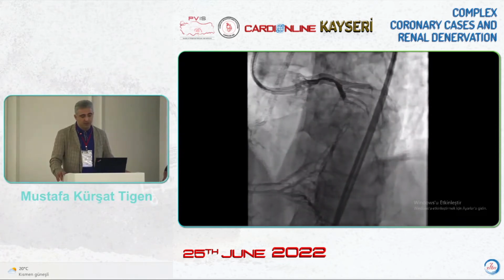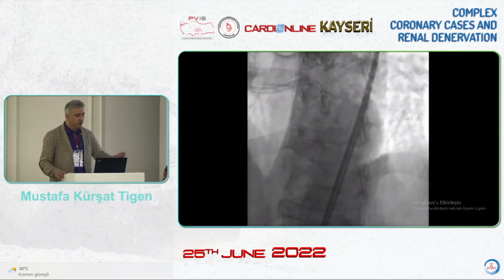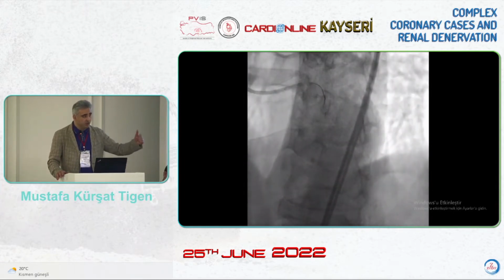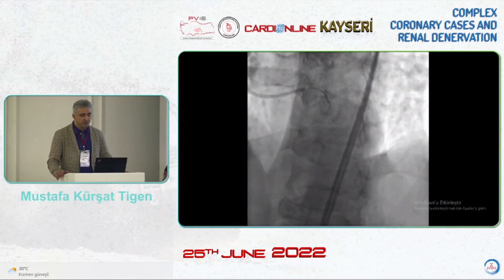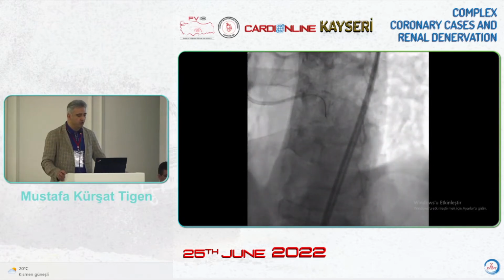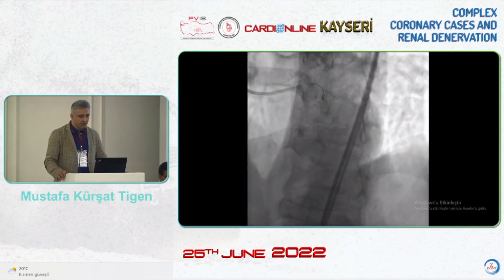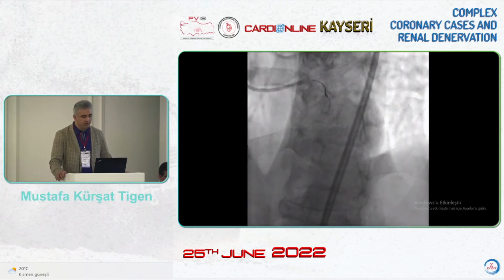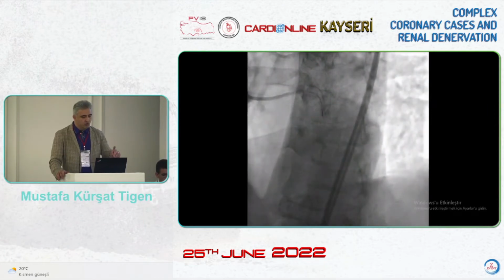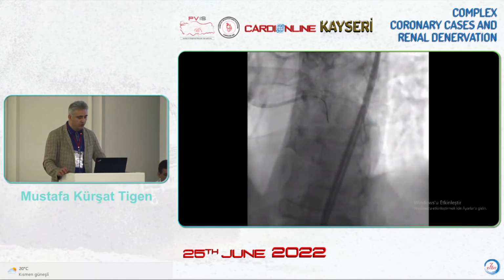This is the latest CTO case. As you can see in this case, the proximal cap is not very clear, and our wire is a Gaia wire, but regarding penetration, we are having a problem. At the second angle, there's a tendency to knuckle. You have to go with the microcatheter and continue with it. There's a tendency to knuckle, there's calcification. It covers the area. And if you do that, there is a different dimension of the work.